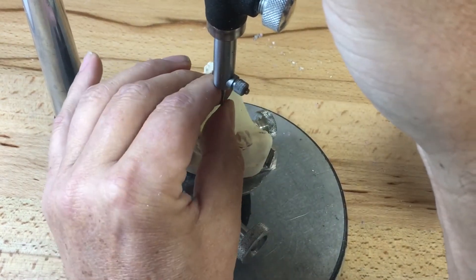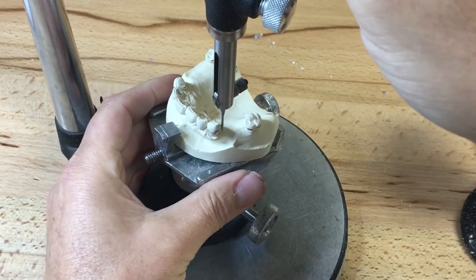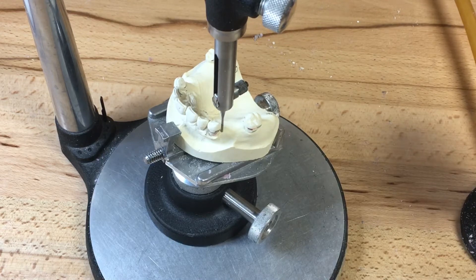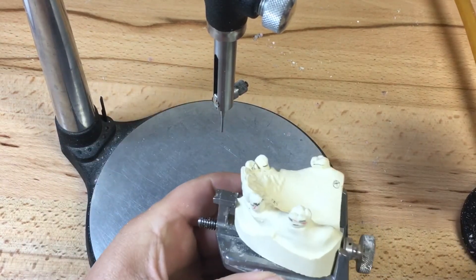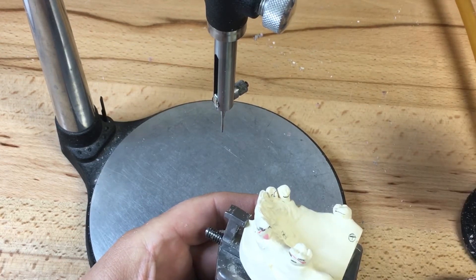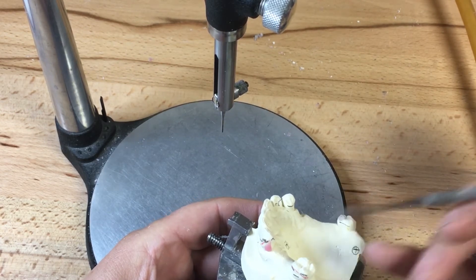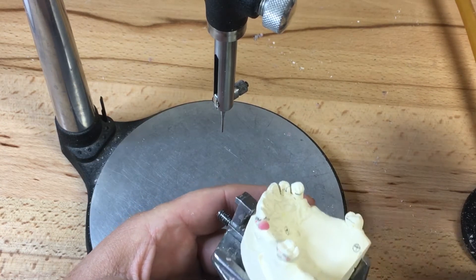Mine's a little bit off-centered here, I'm going to just fix it up a little bit. I'm going to continue now to block out the height of contour — excuse me, block out the guide planes. What I'm going to do is freehand drop some wax on the guide plane. I also have my graphite markings to see where the height of contour goes up to on the distal guide surface of this 1-3, so I'm going to add block-out wax liberally.